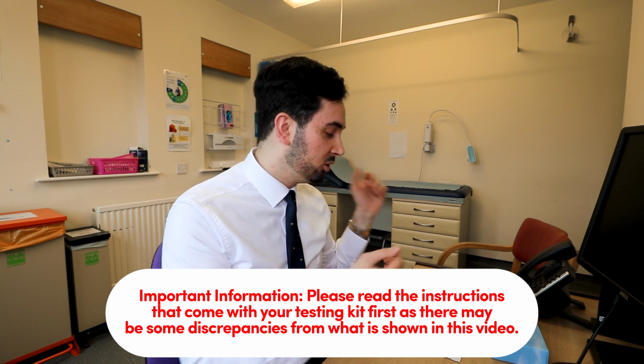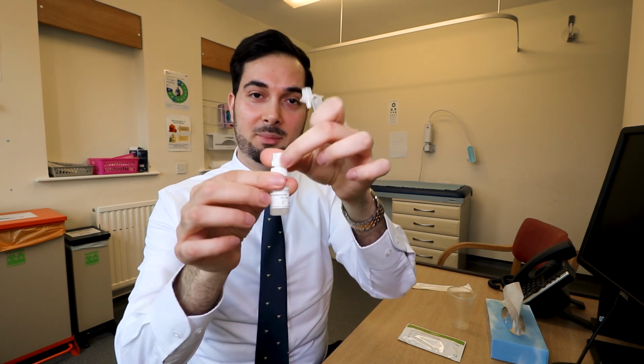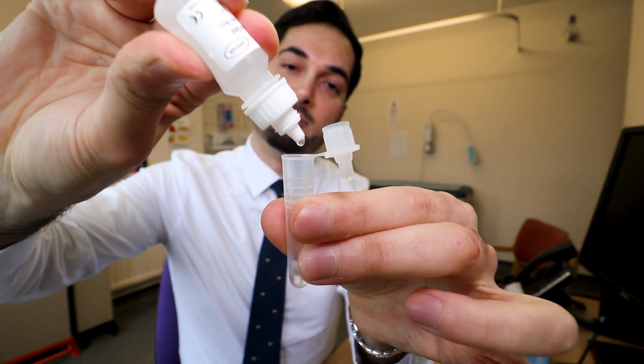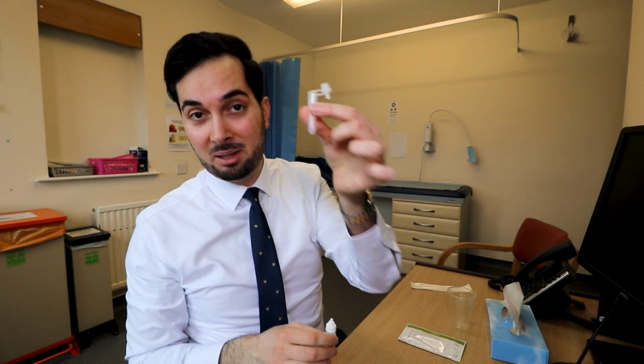So with the IVD one, we need to prepare our extraction solution. We need to put in our extraction tube. Remember, like I said earlier, some of them already come pre-filled, some of them come with a sachet with the correct amount. The IVD one doesn't. It gives you a bulk amount of solution like so, and you put 6 drops within here. So make sure not to touch the sides, and 1, 2, 3, 4, 5, 6, like so. Don't put more than 6 drops in, 6 is plenty enough. And remember, there's only a limited amount of solution in here, so you don't want to waste it.